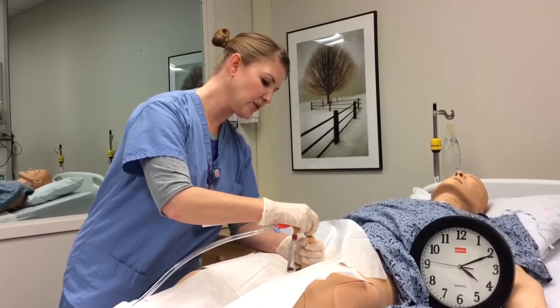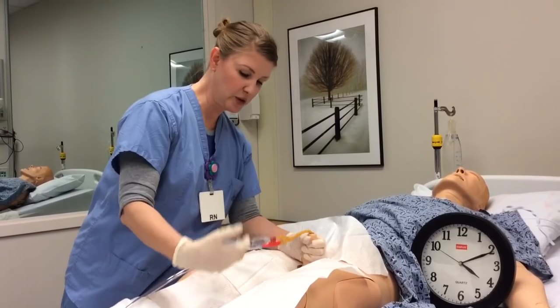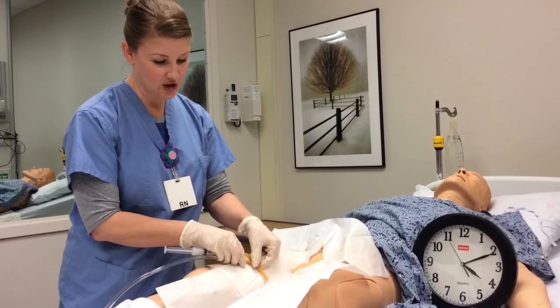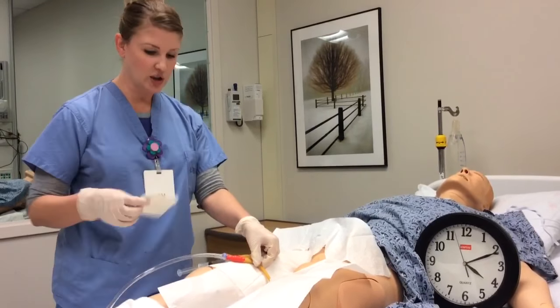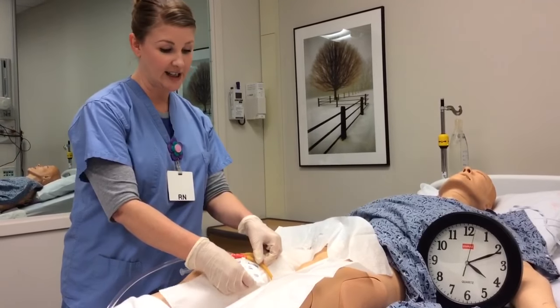Once you get to the hub, you will blow up the balloon port after you see the urine return, and with one inch of slack, use a tube secure. We have a STAT lock here to secure it to the thigh.